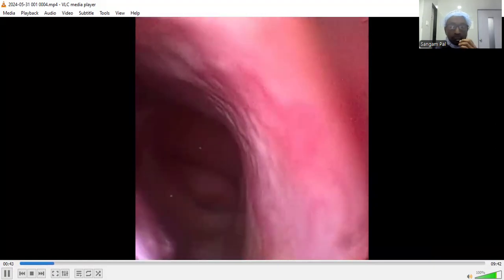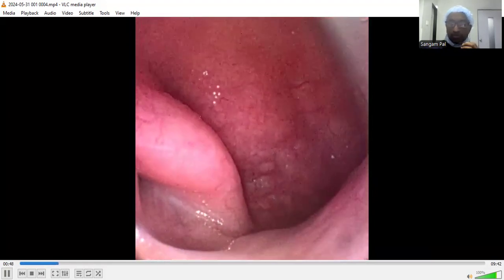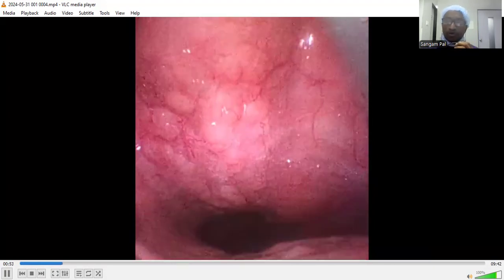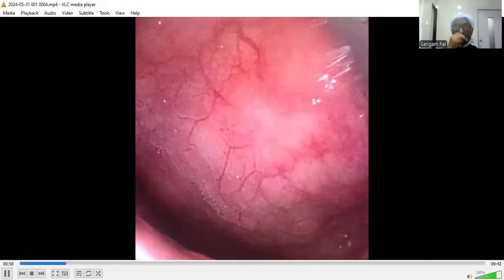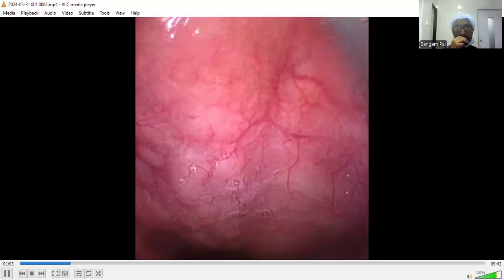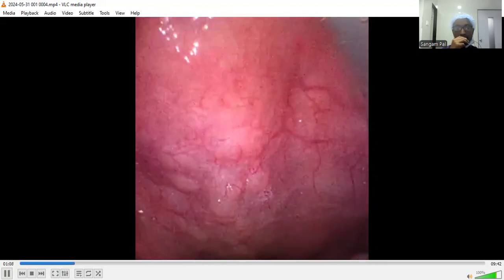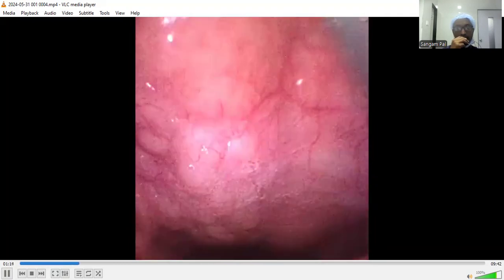He is not able to swallow things, solids; liquid he can swallow. So we are passing the scope through the right nose, preferably, most of the time, after anesthesia and decongestion. And as we know, FEES is like 4S. 4S is structural anatomy, sensory testing, secretion, and swallowability.